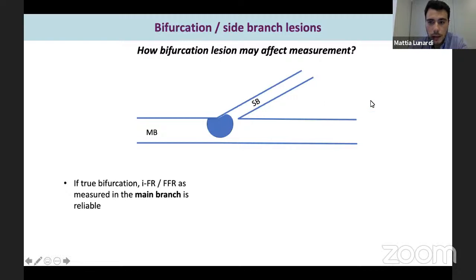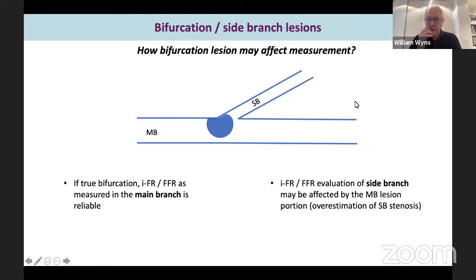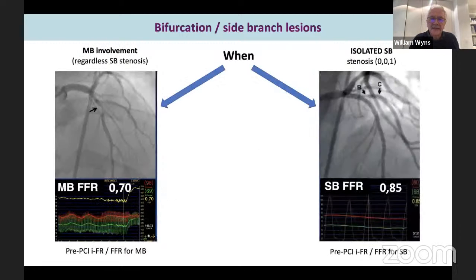Yeah, which creates a little bit of a practical issue because you like to have a wire down there, and I'm always a bit nervous about jailing a pressure wire. So that's a practical issue that you might consider in terms of making the procedure more complicated than it should be. Now, on the next slide, I think you have a couple of nice examples.